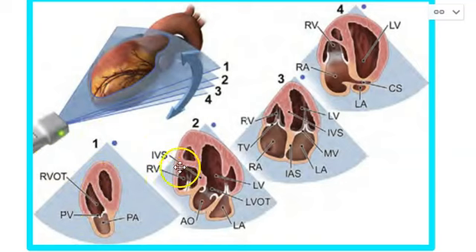And then if you rotate to position 2, you get this slice here, a foreshortened ventricle, but you have a really good shot of the aortic valve, and that's maybe what you're looking for in that view, just a simple rotation. And if you rotate to the third position, that's the perfect four chamber view, right? This is what we get for one of our major views.